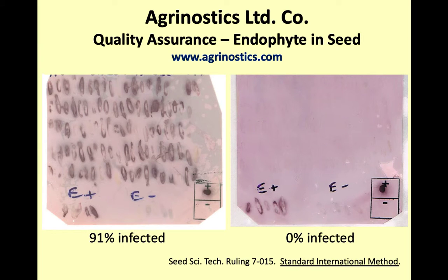Okay, so how do we go about testing to make sure that when you go down and buy a bag of seed that it's actually what you expect it to be? This is just an example of a system that we have developed. It's based upon antibody technology or antibody chemistry.